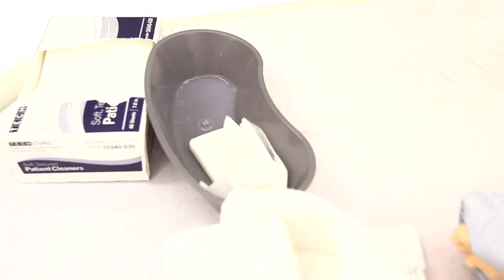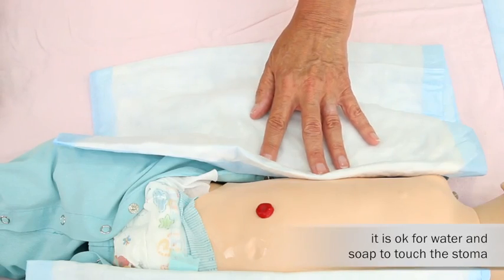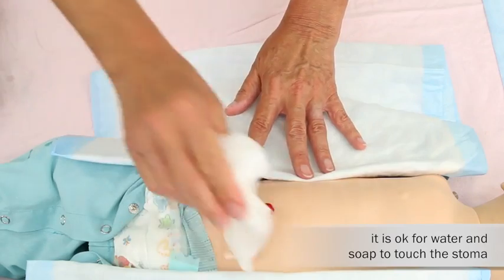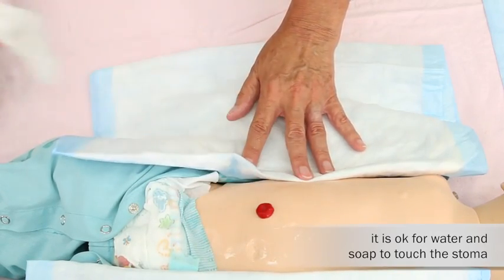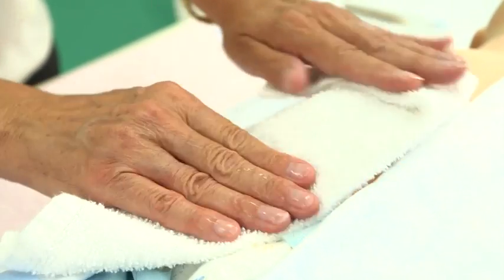If possible, all appliance changes are done at bath time. It is okay to submerge the stoma in water. Nothing will go inside. It is good for the peristomal skin to soak in water. Wash the stoma and the peristomal skin with a non-oily soap and warm water. Rinse the stoma and the skin with warm water and pat dry with a washcloth or dry wipes.